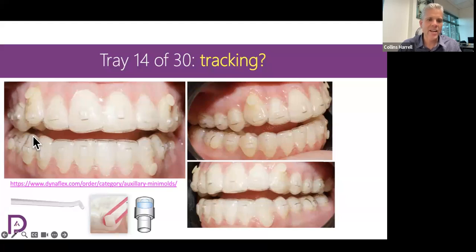And why don't we stay in aligner number 14 for 1 extra week? And let's have the patient really focus on using chewies right through this front section. So as many times as she can remember throughout the day, for about 2 to 3 minutes, just put that chewy in there and bite, bite, bite, up and down, up and down. And as long as I've created the space, that pumping motion is going to force those teeth to fit right up into this aligner just perfectly. Okay, so we can make sure that these things get right on track before we keep moving on.